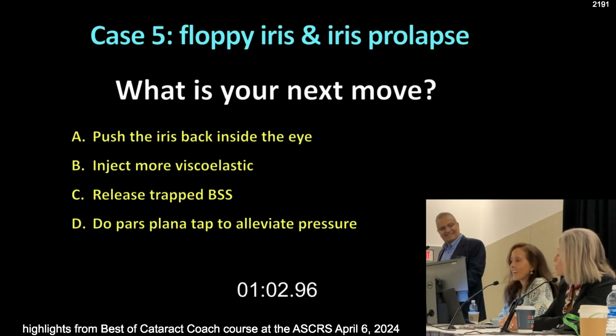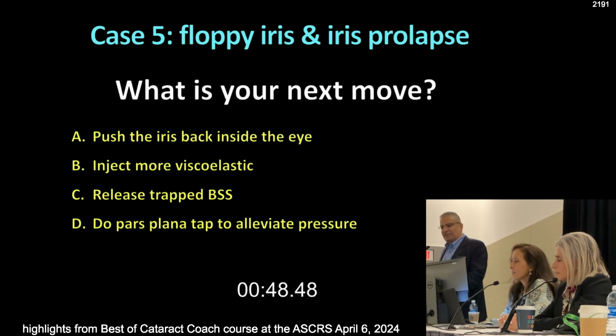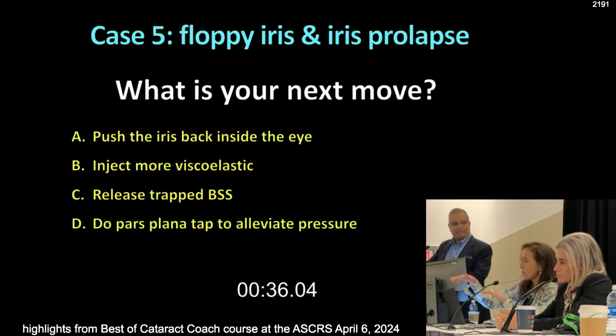Yes, too much fluid. And also you want to make your incision a little bit more anterior to get less prolapse. Would you start more in the clear cornea then? Yeah, a little bit, just in these cases. Okay, so you want no more viscoelastic. Normally the resident technique is, well, put more viscoelastic and push the iris back in. No, you want to decrease the pressure gradient. So solve the gradient, and then the iris will go back.